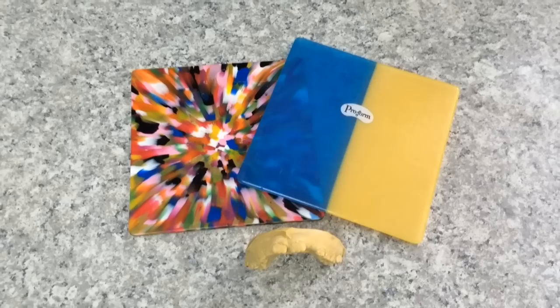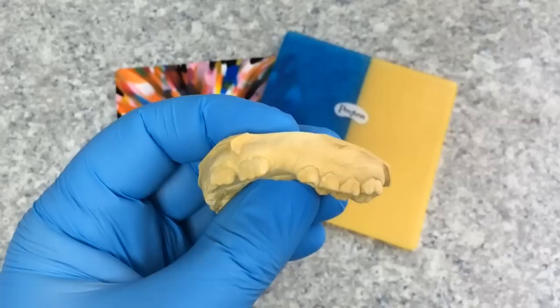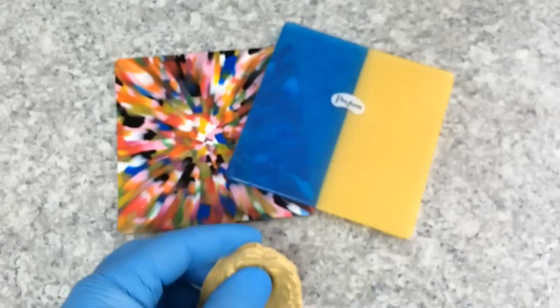So first of all, what we do is we take an impression of the mouth. From that impression, we end up with a stone model and this is basically a duplicate of the mouth. So we trim it up to be nice and thin and from here then we grab the mouth guard blank that we are going to be using.